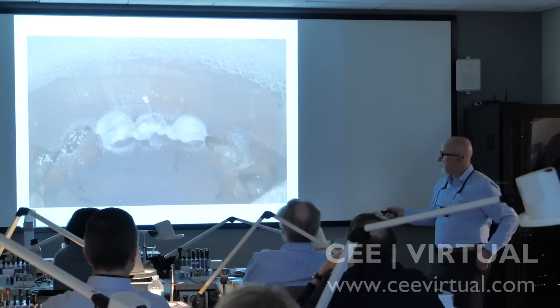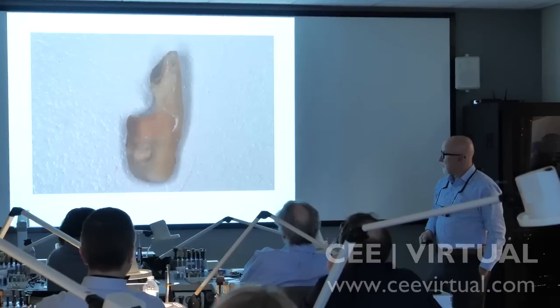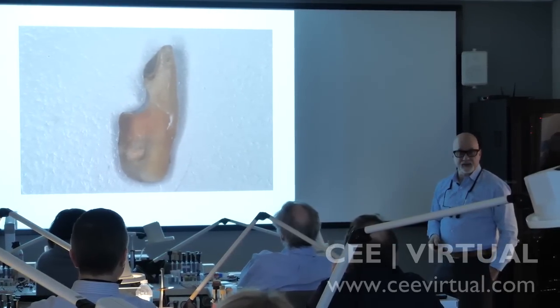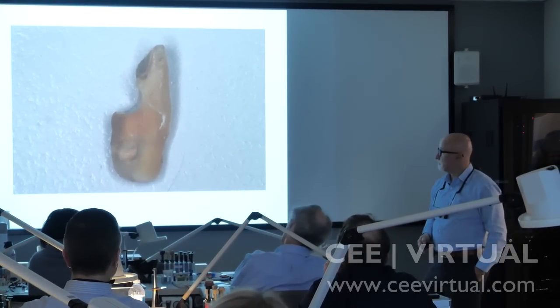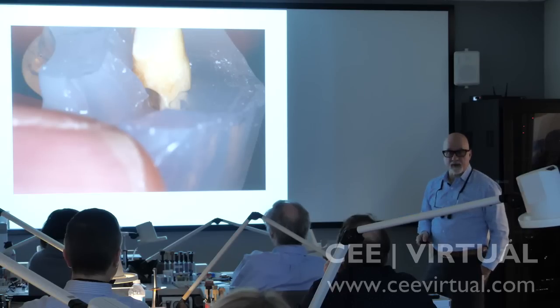So I actually take a drill, drill the lingual out, and then we're going to cut a little slot in the tooth. You can see we now have room for the dentopreg and the composite.